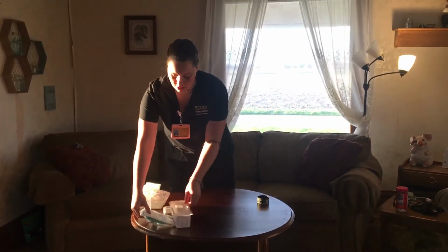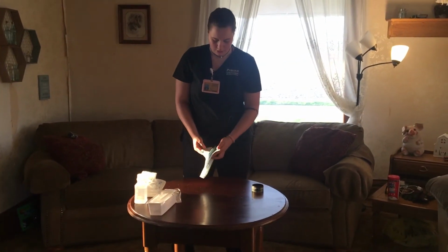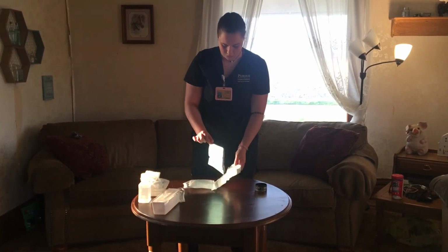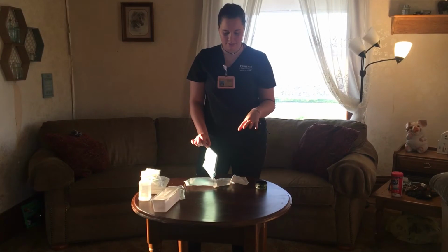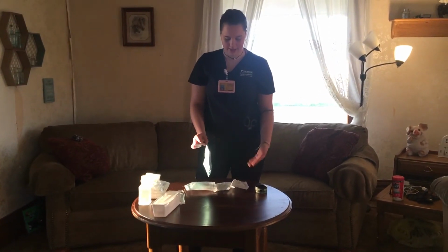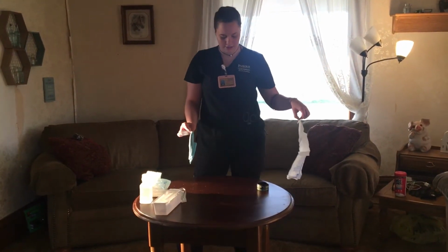So we already got all of our equipment out here. So you want to open this up. And this work area has been cleaned and it should be elbow height, but this is the tallest table I have right now. So then we're gonna discard this.